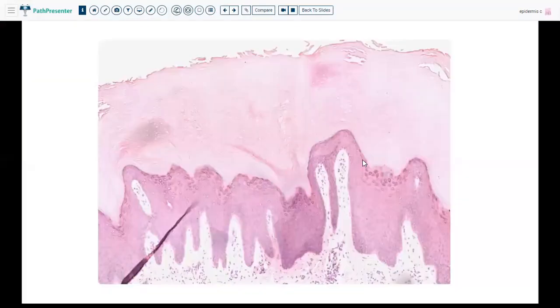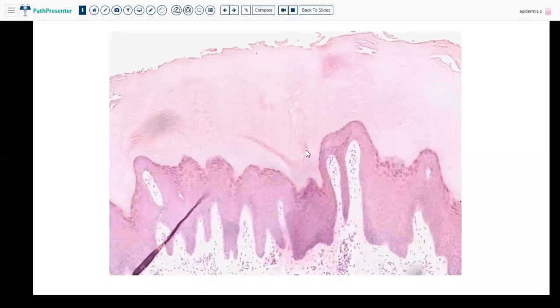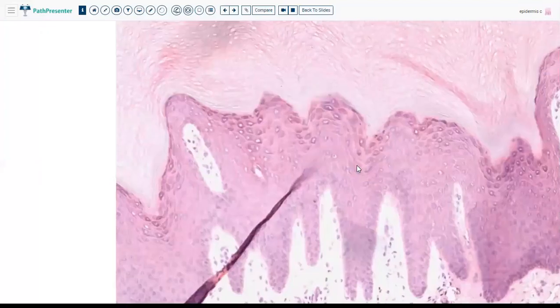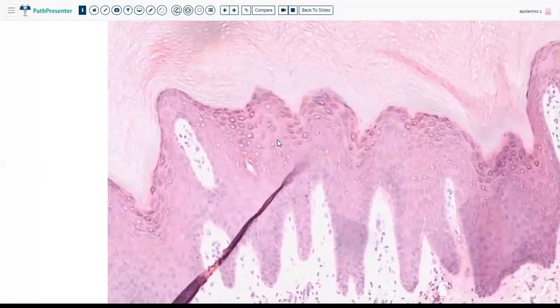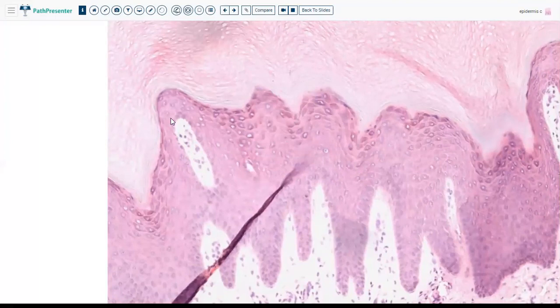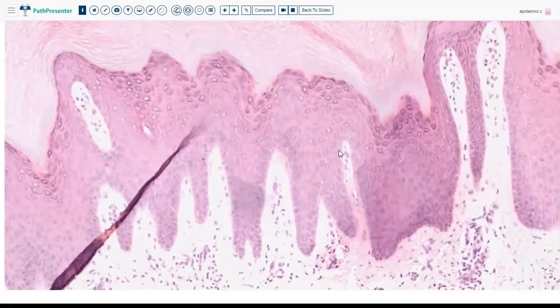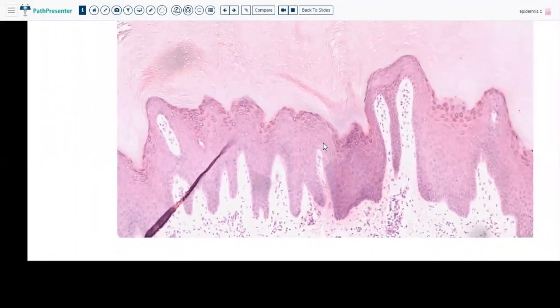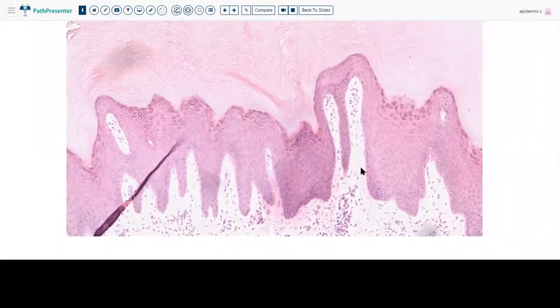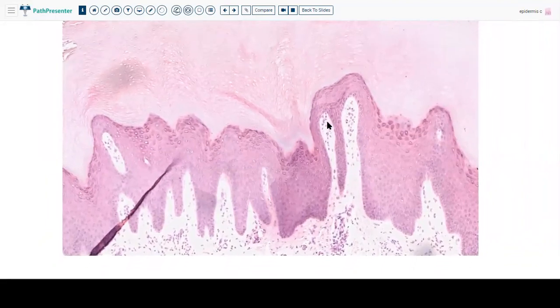The next example is lichen simplex chronicus. We saw earlier how hypogranulosis looks. Now you can see hypergranulosis — see how the granular cytoplasm of cells goes all the way down, much more than the two to three layers normally allowed. There is also irregular acanthosis, as I mentioned. Regular acanthosis is typical of psoriasis. Irregular acanthosis is typical of lichen simplex chronicus and prurigo nodularis.